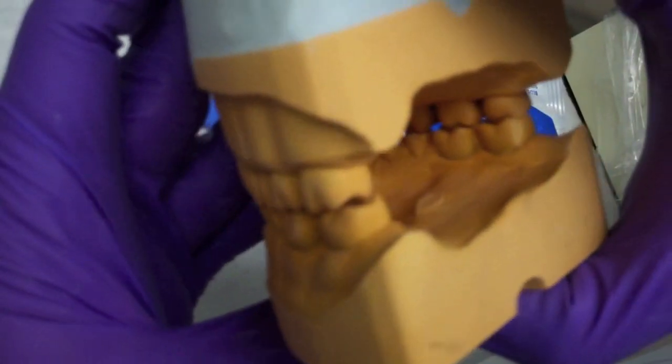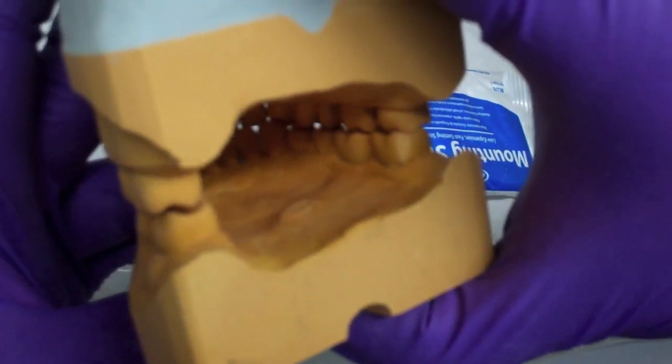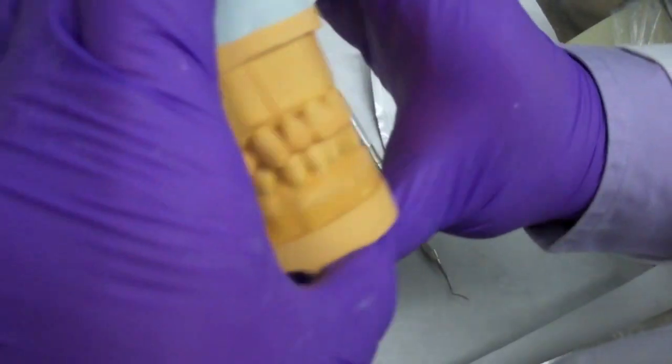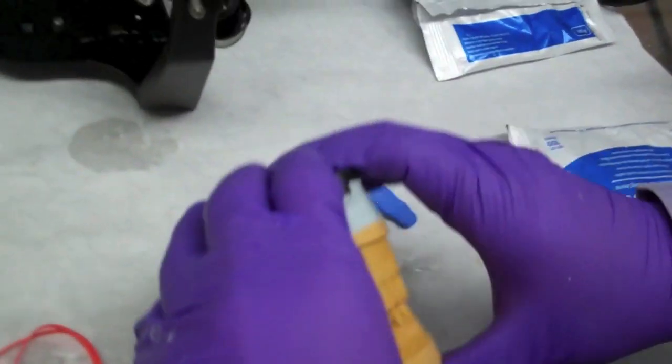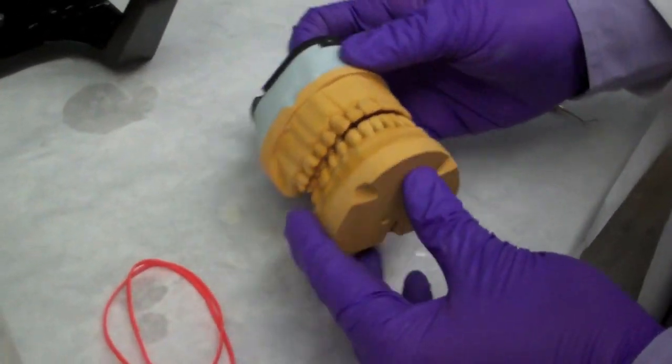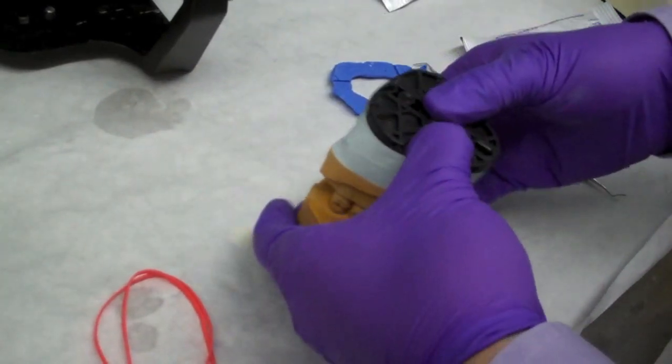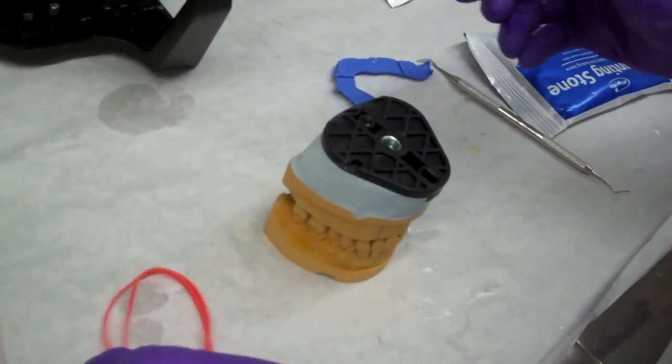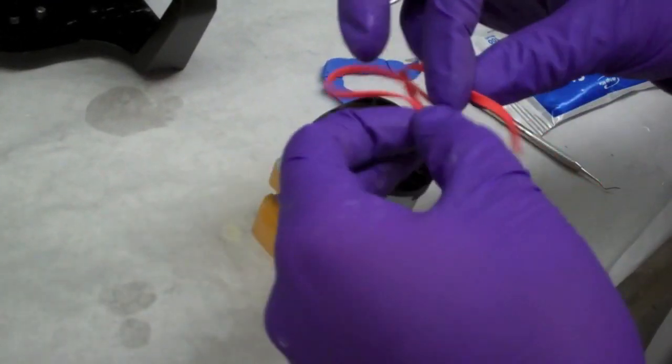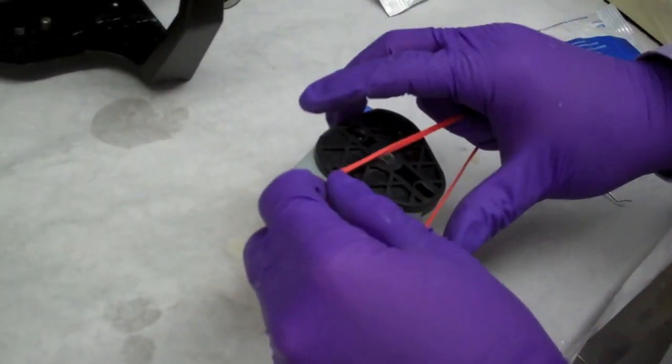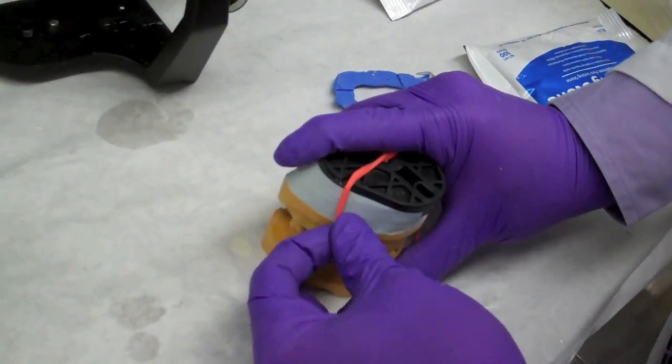Now it is time to mount the mandibular cast. When looking at the occlusion, you can see that on the patient's left side, there is no contact on the last molar. In this case, we are looking for maximum intercuspation, which means as many teeth in contact as possible. Make sure anteriors are in contact. By using a rubber band, we ensure that the occlusion will not move while articulating the mandibular cast.